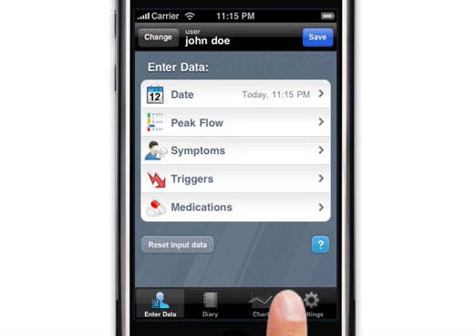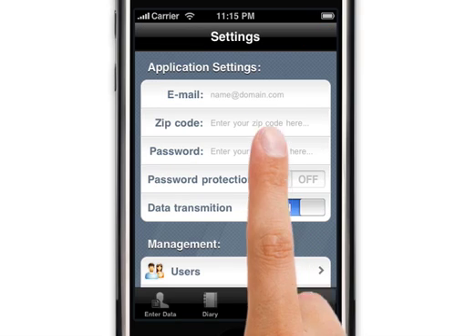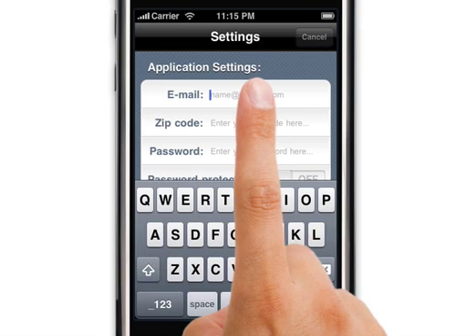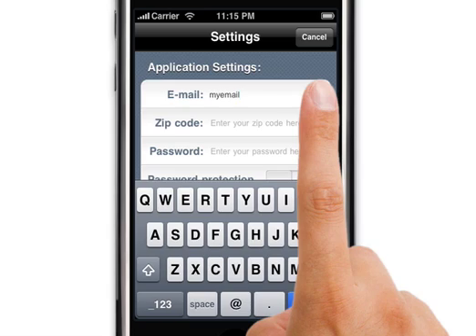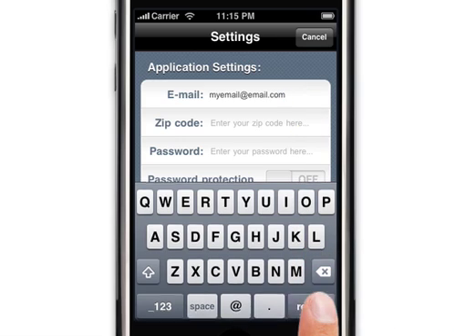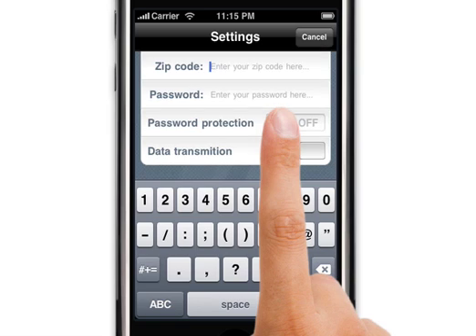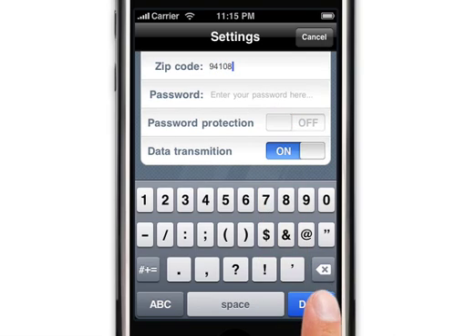We recommend to then go to the settings page and enter more of your information, such as email address and your password. This information is used to allow you to send a report to your doctor when you want, have access to the AsthmaMD website, as well as adding protection to your application to safeguard your data.